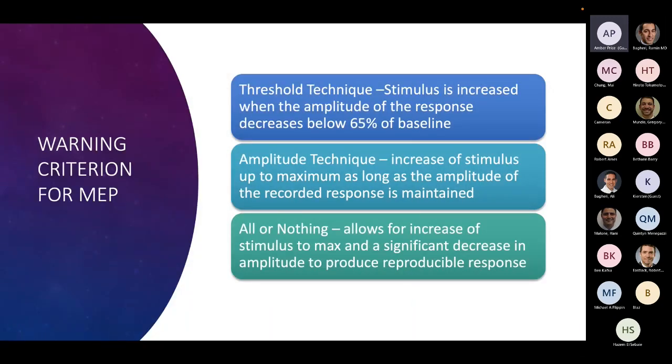So for MEPs, there's discussion about what is the appropriate warning criterion for them. There are 3 different techniques that are described.